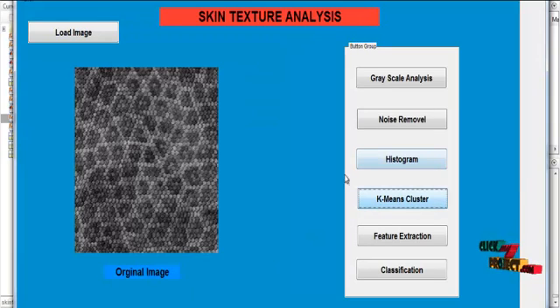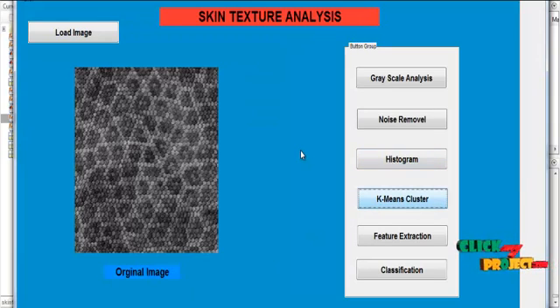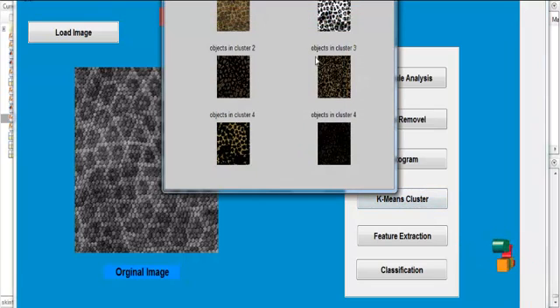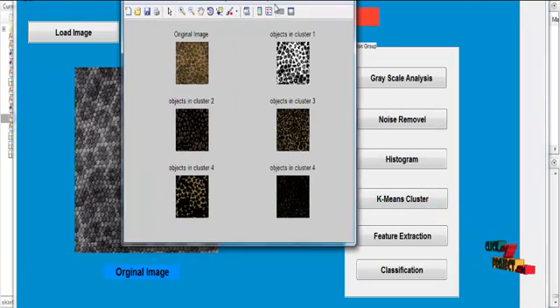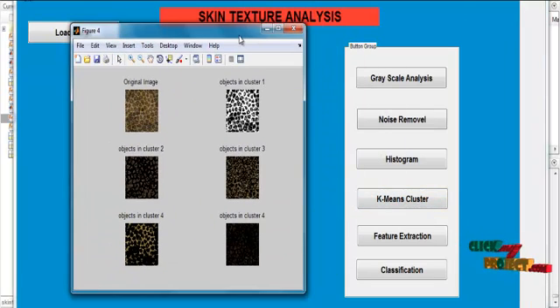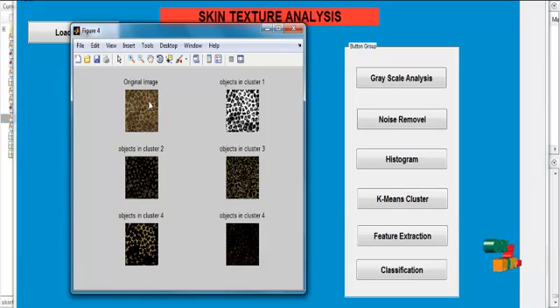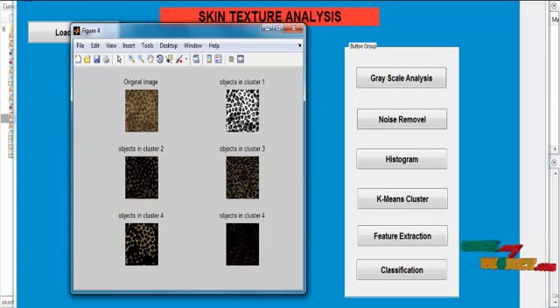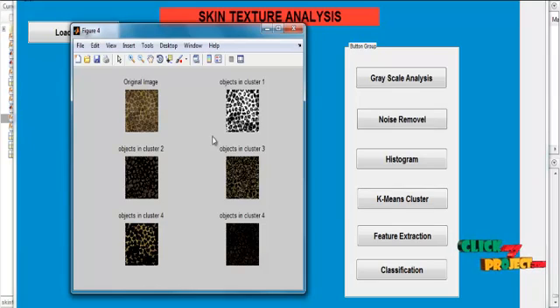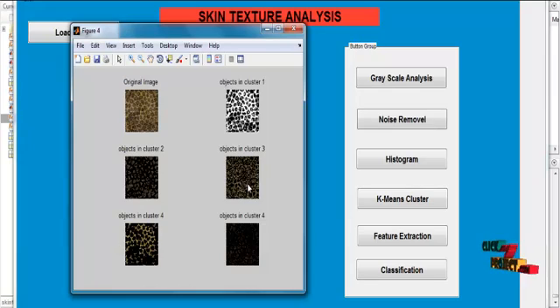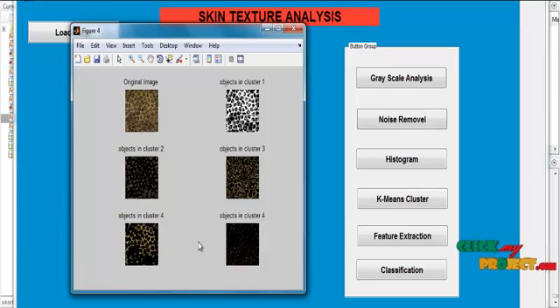Then apply the k-means clustering. The k-means clustering is used to segment the image. After using, the original image is shown in subplot 1. In subplot 2, the cluster index image is shown. Then the remaining four images represent the four types of clusterings.